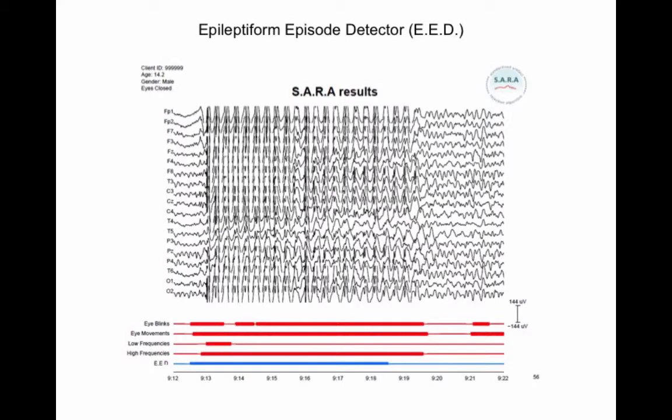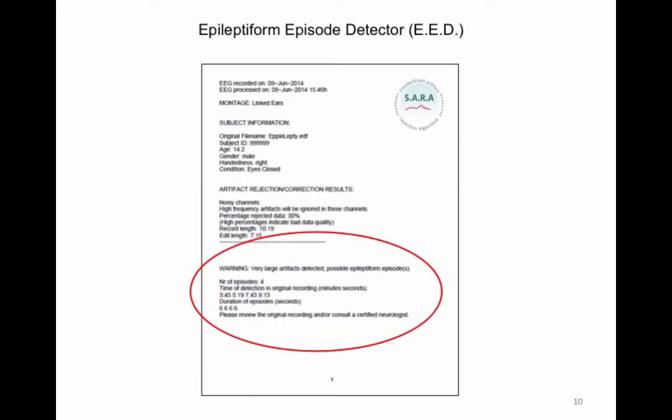Finally, SARA also implements an epileptiform episode detector, which detects large epileptiform episodes and is represented by blue bars in the bottom of the SARA report. When such an event is detected, the SARA summary page in the QEEG Pro report will show a warning stating that very large artifacts were detected, which were possibly generated by epileptiform episodes.